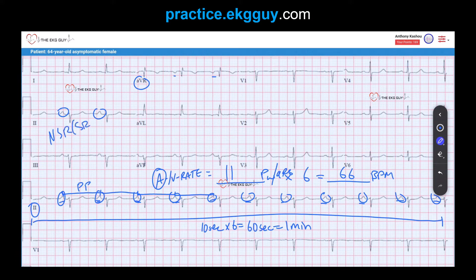Because we have a sinus rhythm with a normal rate, this is, in fact, normal sinus rhythm. Note that "sinus rhythm" used alone also infers a normal rate. Now the second major finding we need to look at is the mean QRS axis.